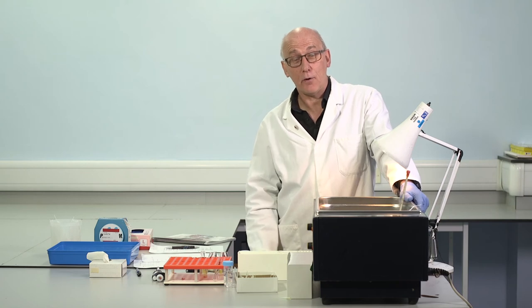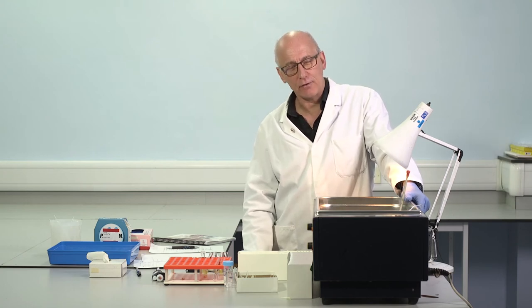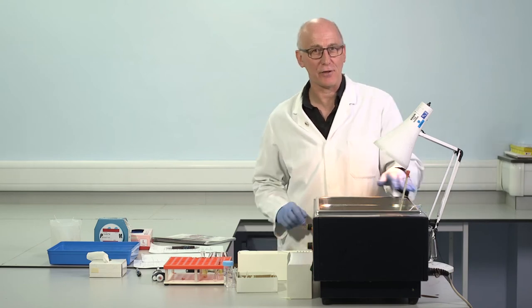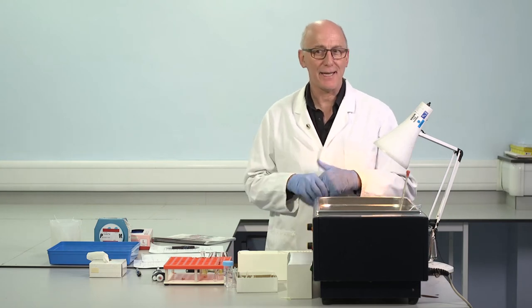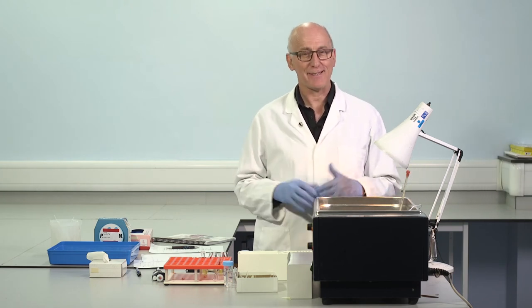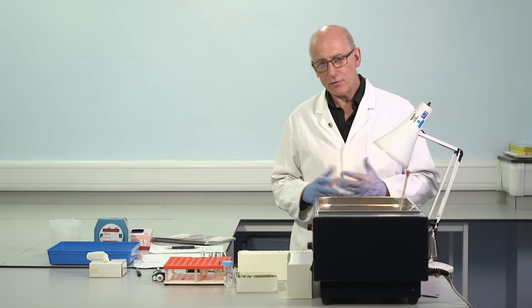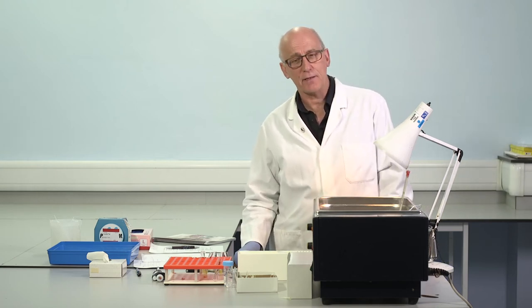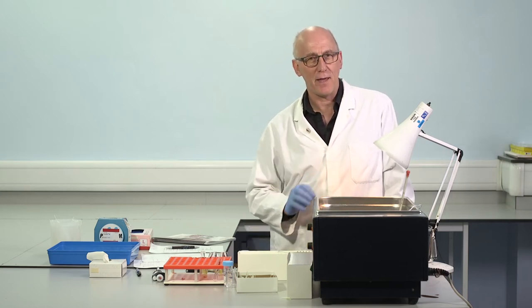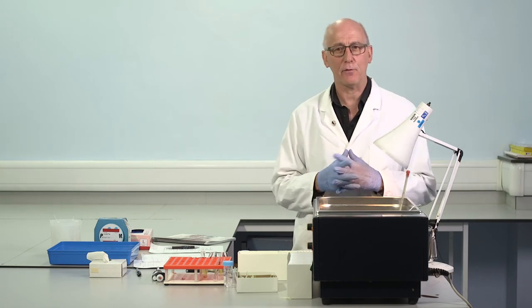There are broadly two possibilities, as you know. We could be dealing with deficiency, a missing clotting factor. Or alternatively, the clotting factors are all present and something is interfering with the reaction, something is slowing down the reactions, for example, an inhibitor. So we have a number of tests available to us to further investigate these defects, specific factor assays, specific inhibitor assays, and so on. But of course, these are quite time-consuming tests, and these are expensive tests.